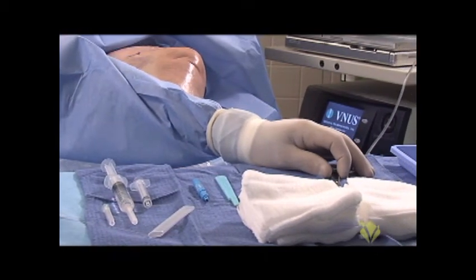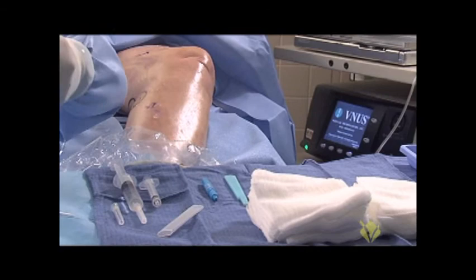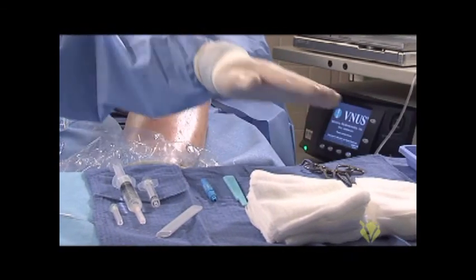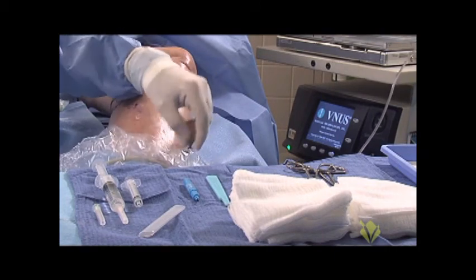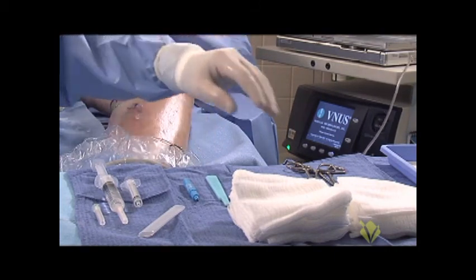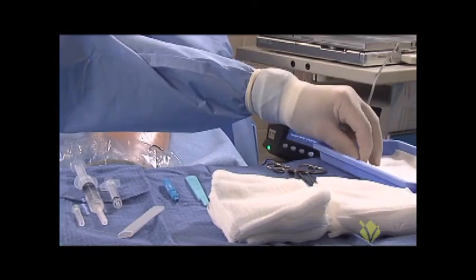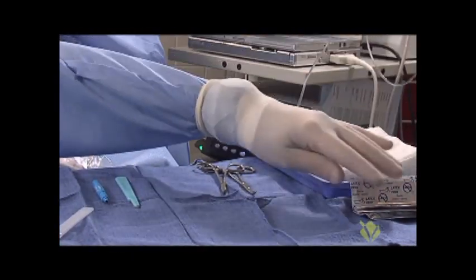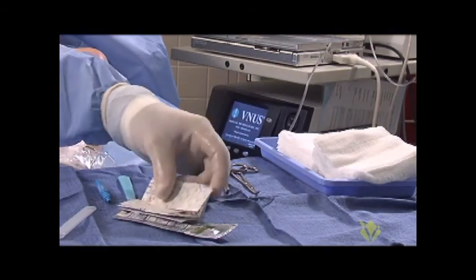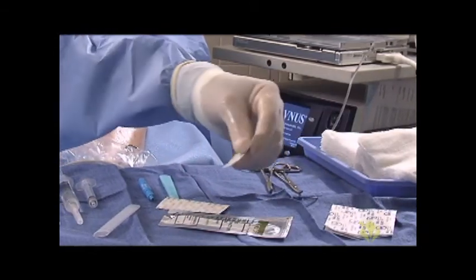A couple of basic hemostats. I usually use those to keep control of things like the ultrasound probe with its sterile cover and the tumescent tubing, which we'll get to. We don't need a big tray — just a little stuff to clean up at the end of the case. And over here we have a selection of band-aids on the tray.